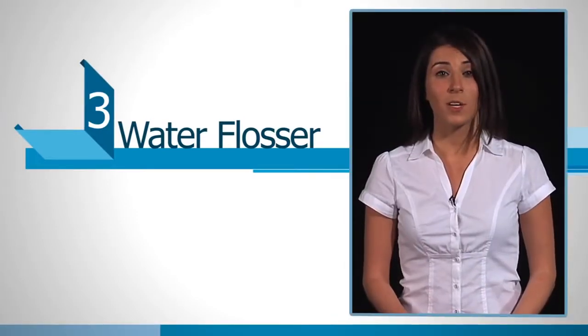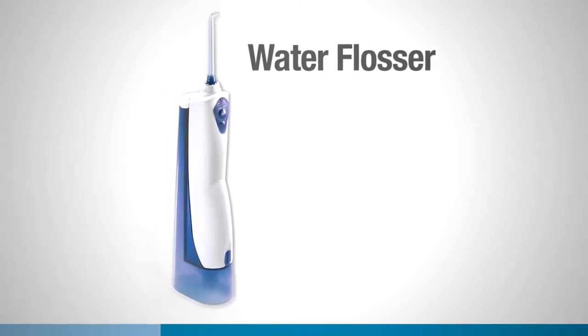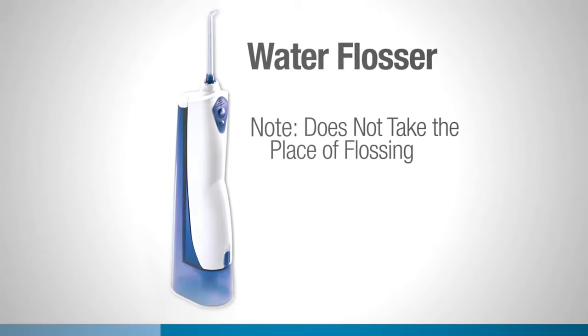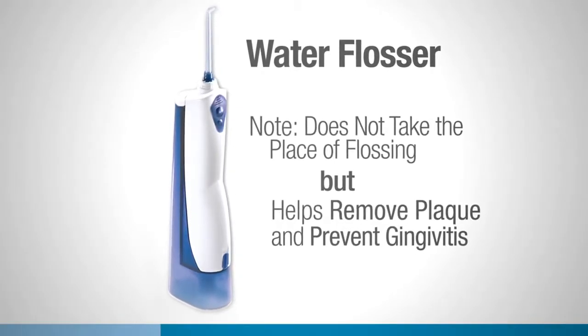Many people feel much more confident with their oral health when they include a water flosser in their oral hygiene routines. Please note that a water flosser does not take the place of flossing, but it does a great job of helping to remove plaque and prevent gingivitis when used properly. You'll want to follow the recommended procedure provided by the manufacturer of your water flosser, but for this particular model, I fill the device with warm water.